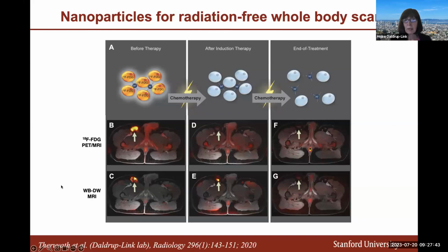So we believe that the difference that we saw between patients with lymphoma and sarcoma is probably not because of the biology of the tumors. It's probably the timing of the scan. In patients with lymphomas, we obtain early follow-up scans after 2, 3, 4 weeks of chemotherapy. In patients with sarcomas, we obtain follow-up scans after 8, 9, 10, 11, 12 weeks of chemotherapy. And so in a patient with sarcomas, we are already in that stage when we have our first follow-up scan.